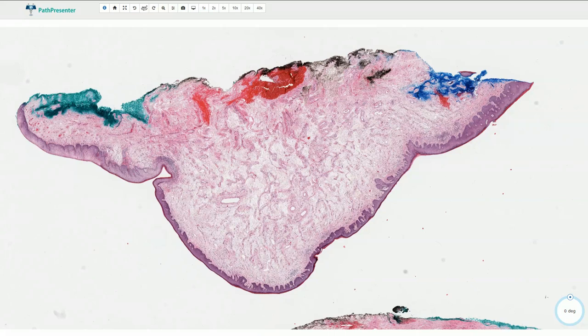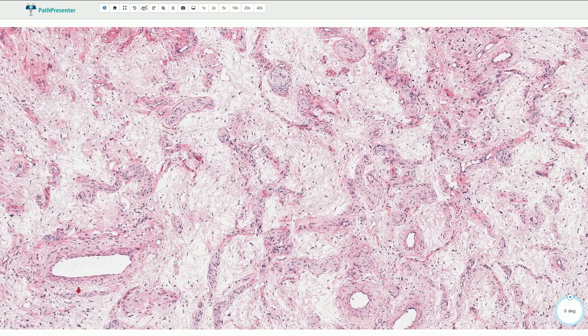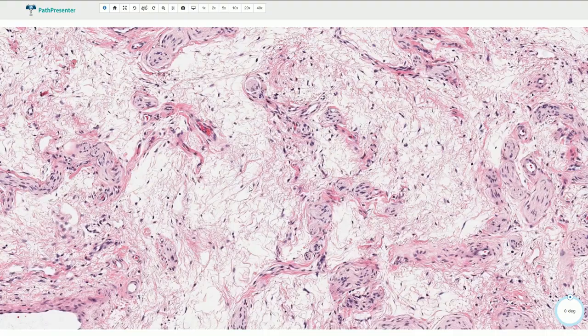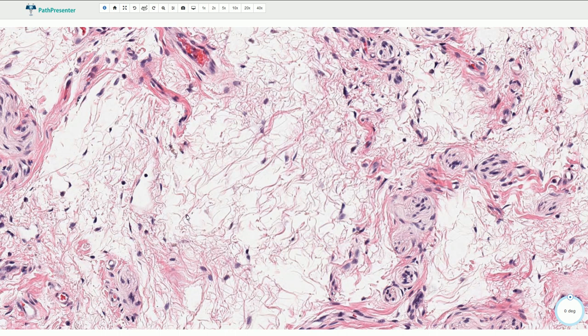Here we see the epidermis on the surface, and this part of the slide shows aggressive angiomyxoma. If we go closer, we can see that the lesion is relatively hypocellular. It is myxoid and it is composed of small spindle-shaped cells with bipolar eosinophilic cytoplasmic processes.